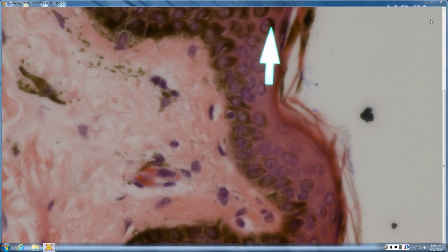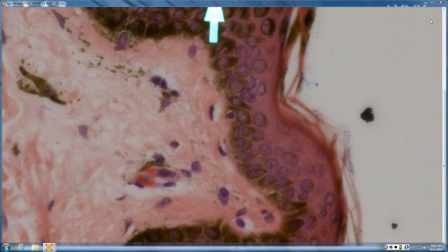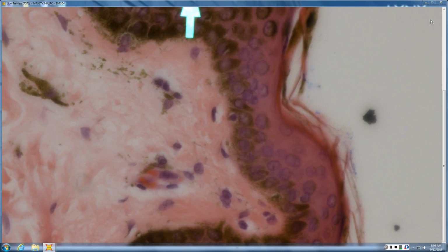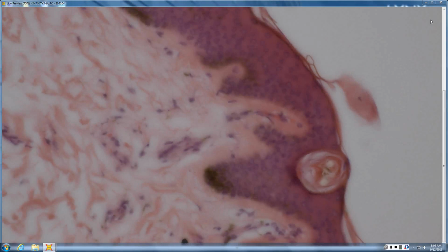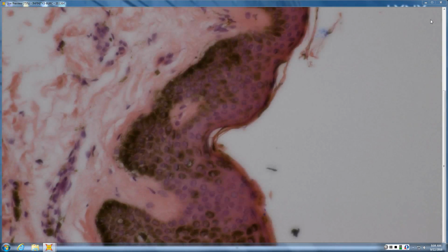If they sit as little hats on top of the nucleus, it's probably a keratinocyte. Melanin is evenly dispersed within melanocytes and clumped within keratinocytes. It may not be exclusively at the cap, but it condenses to a cap, like a little umbrella protecting the keratinocyte nucleus, like a sun hat, like the baseball caps bald guys wear to protect their heads from the sun. You could always do a stain for confirmation, but probably there's no significant melanocytic proliferation. That's all in keratinocytes.